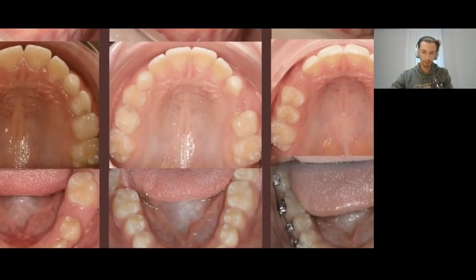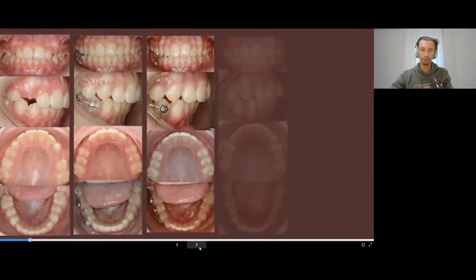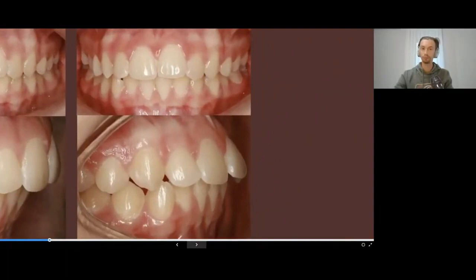We are helping to erupt, forcing the seventh tooth into the arch with a segmented arch wire. We distalize the posterior segment with mini screws. We stabilize the posterior teeth with mini screws, align the fourth quadrant, and fix the retainer to secure the result we managed to get.